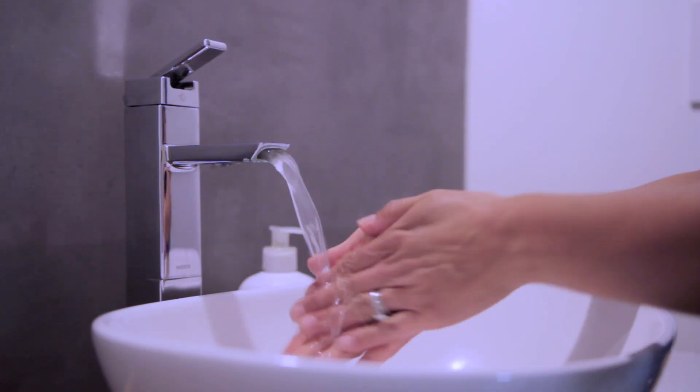Be sure to do your hand hygiene and verify your six rights: right patient, right medication, right dose, right time, right route, and right documentation.